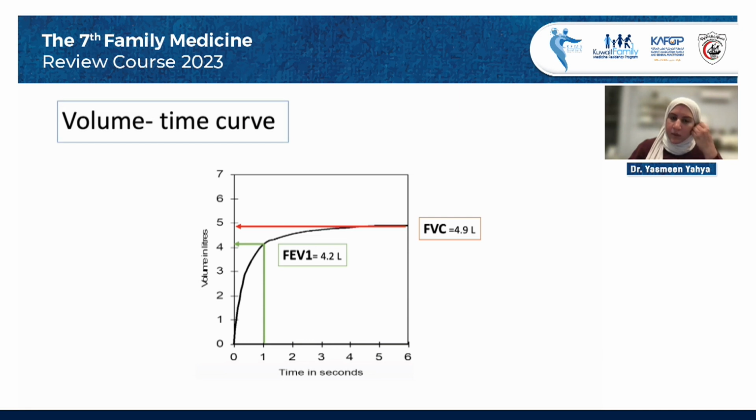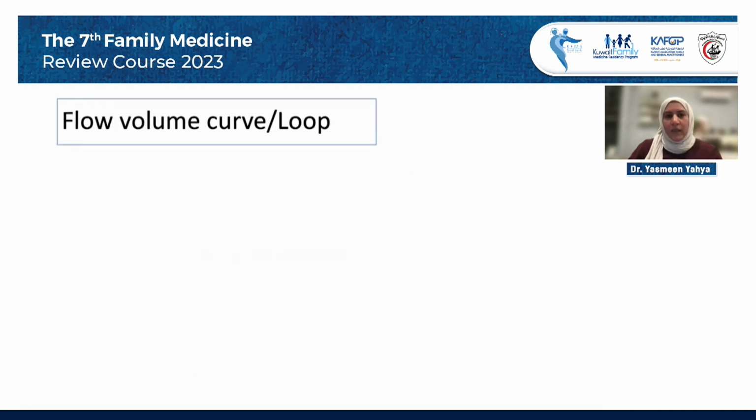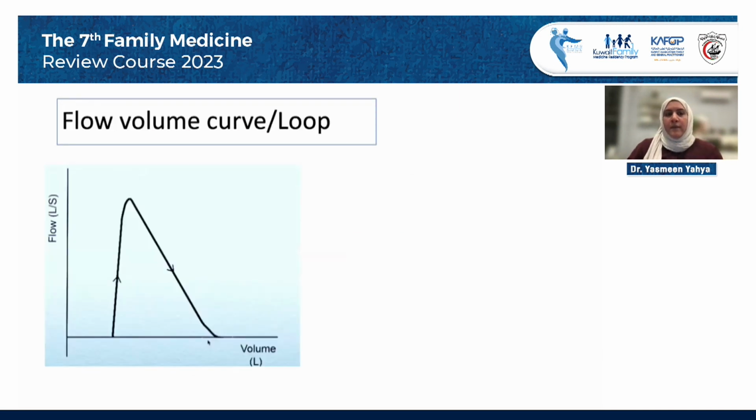For the flow volume loop, the flow of air, in liters per second, is plotted against the volume. So the patient will exhale with full force.